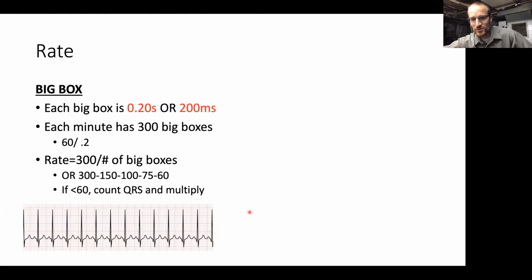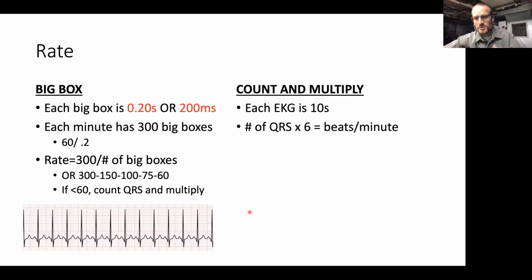It's greater than 150, less than 300. And it's closer to 150 than it is to 300. So like, I don't know, 170. The other option is to count and multiply.